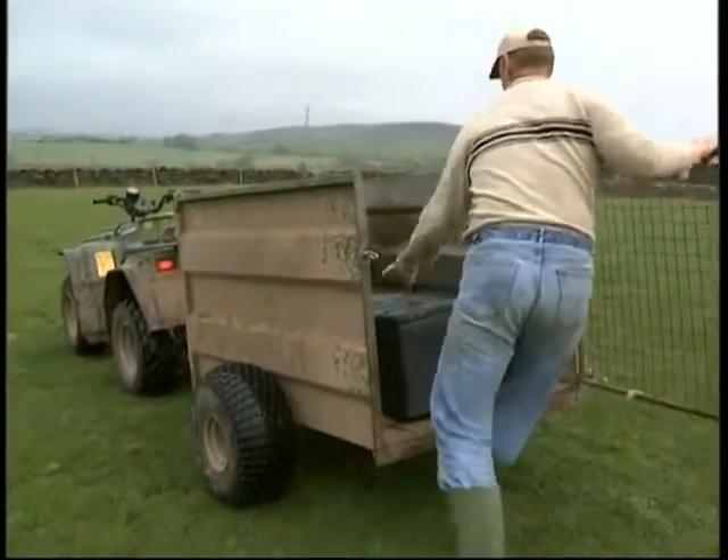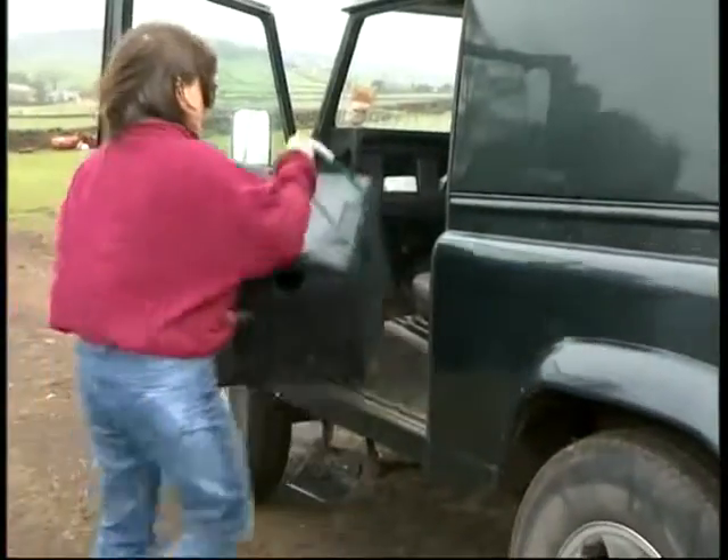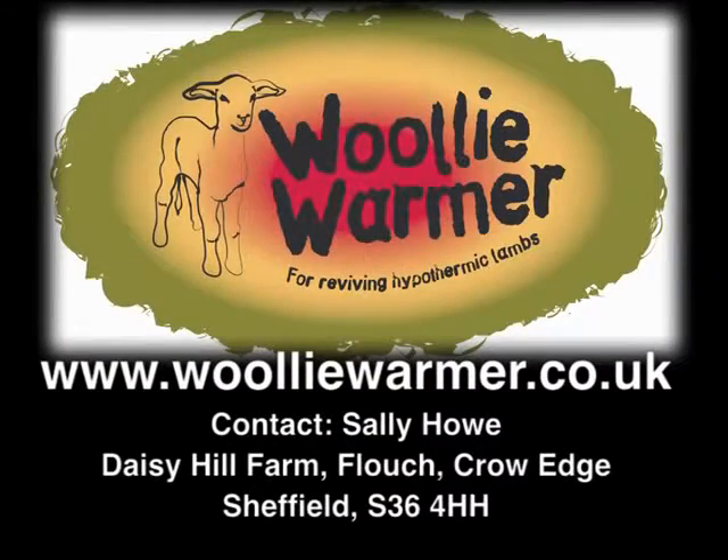Due to its compact size, the Woolly Warmer can be taken into the field and fits easily in the back of a quad, or in the footwell of a Land Rover or truck. For more details on the Woolly Warmer, please contact the details on screen.